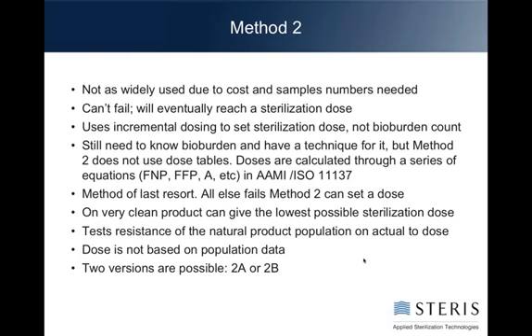Okay. Method 2. We're not going to go into a lot of detail on this, but I want you to know it's there. It's not as widely used today because of how many samples it needs, but the beauty of it is it cannot fail. It will always eventually reach a sterilization dose for you.